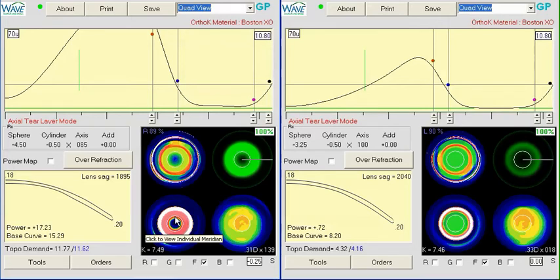And like I said, I've never really done this. I'm not sure if this is a patient you particularly want to experiment with. If not, I would just aim for a single vision distance in the right eye, single vision reading in the left eye, and see if that kind of vision is going to work out for the patient.